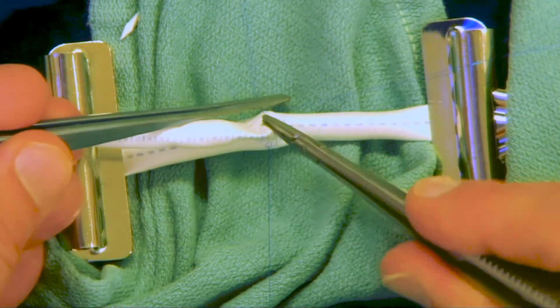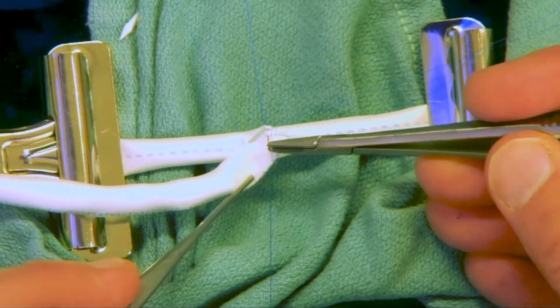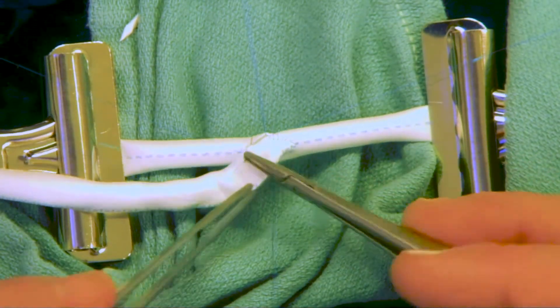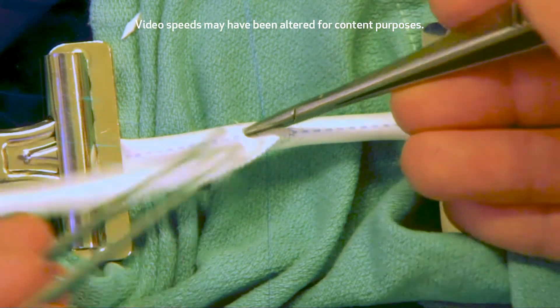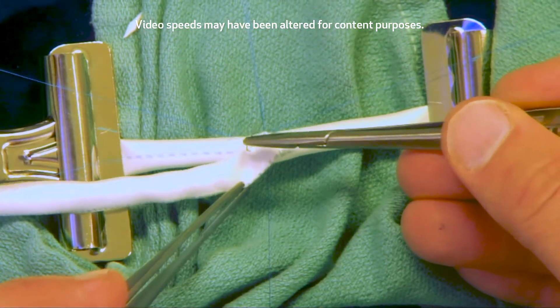We'll suture towards the stay sutures, and once we get to that area, it's time to switch and go to the other suture. That way the stay sutures help hold the anastomosis open so we can see it properly. We've now shifted to the opposite one, going back in at the heel so that we can suture inside out on the recipient vessel at the bottom.